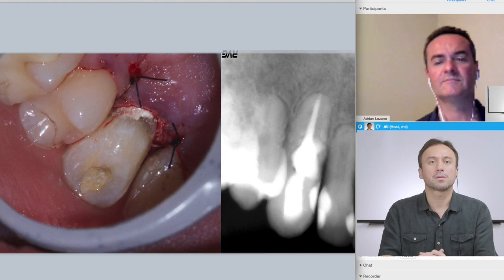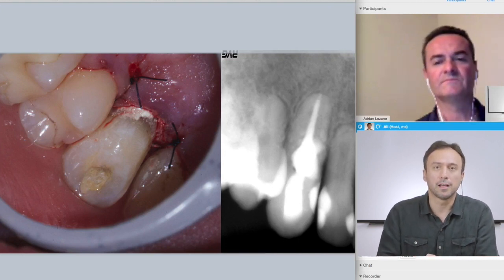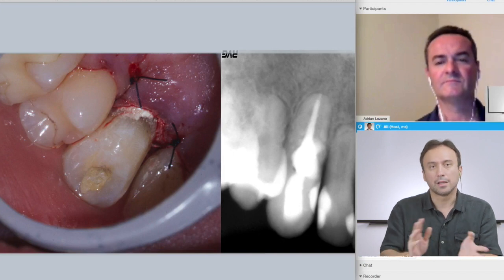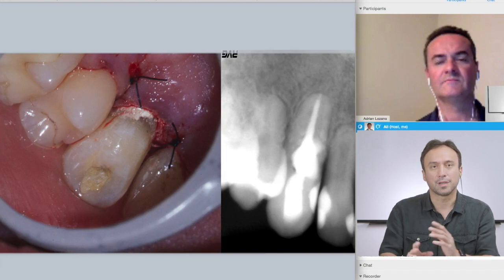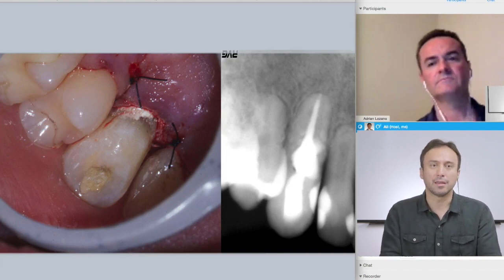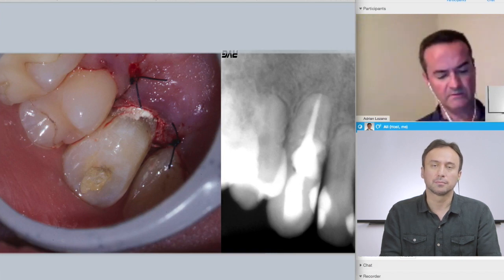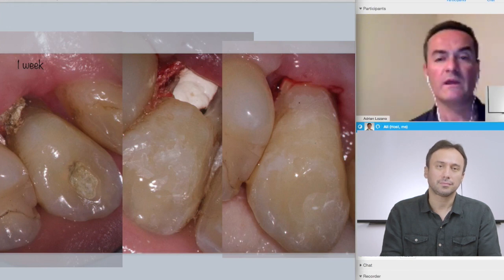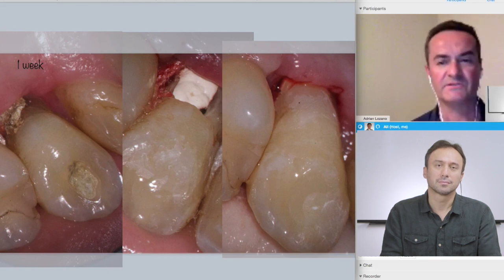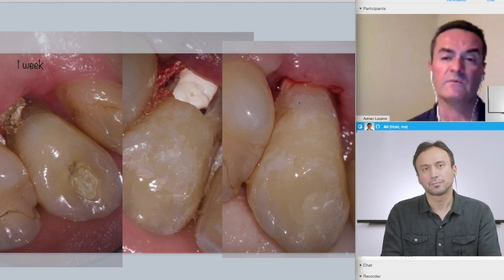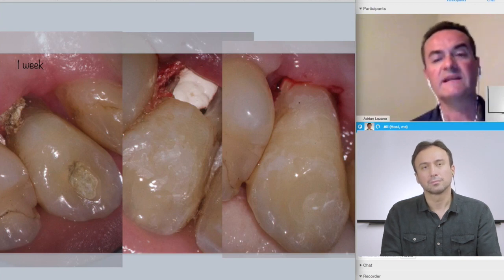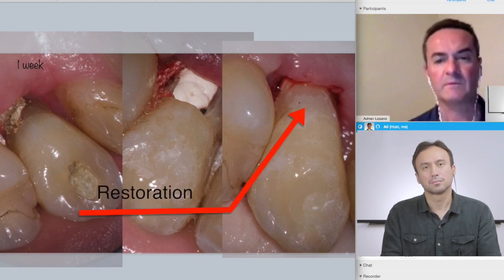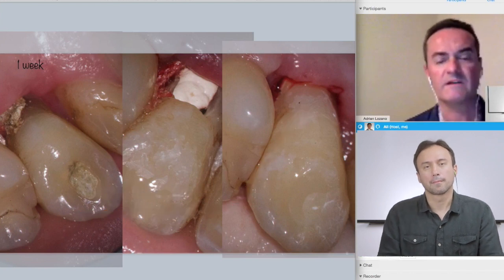On the immediate post-op, there is a very nice and dense fill in the area of the resorption, with a coronally positioned flap placed to cover as much of the material as possible. How did the patient fare immediately post-operatively? It was perfect — no pain, no symptoms, no bleeding or swelling. I saw the patient at one week to remove the sutures, and in that week I performed the aesthetic restoration of the palatal portion with bonding resin composite.